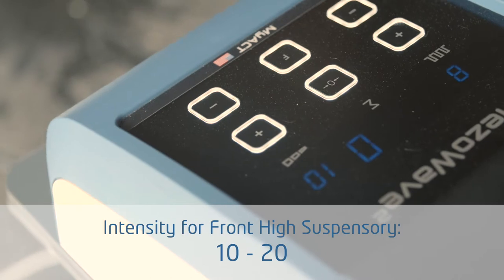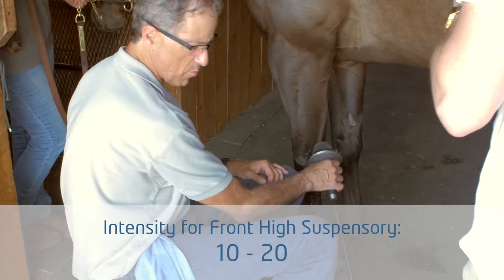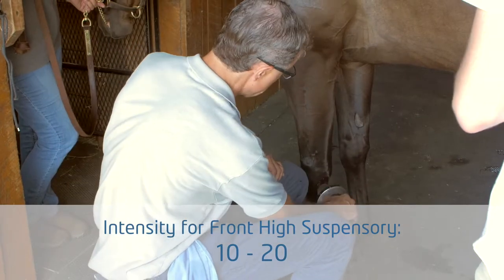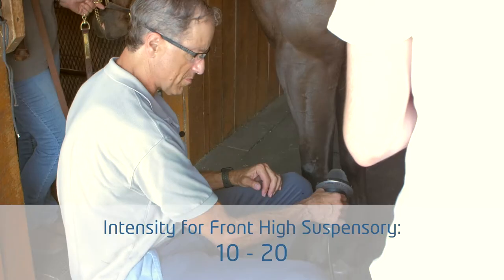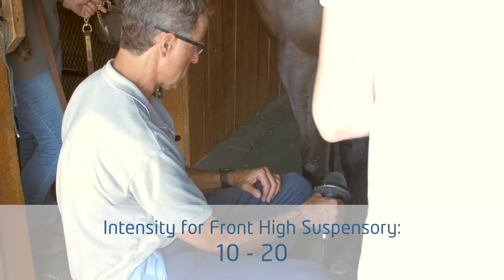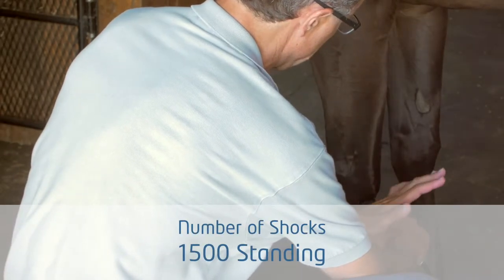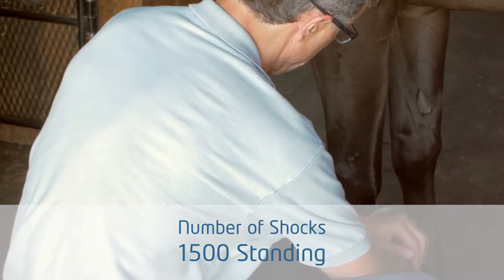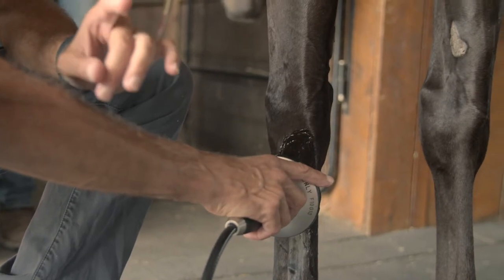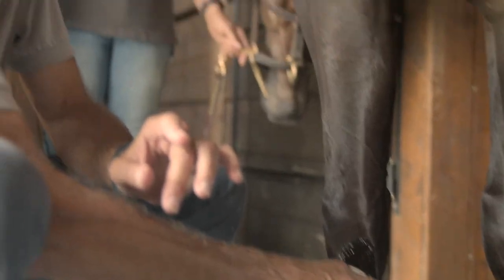I'm starting off at level 10 for safety purposes, at eight clicks per second. As expected, he doesn't have any problem with that. I'm going to go all the way up to 15 — he's fine — and then up to 20. I start here and put about 1,500 clicks in standing, slowly migrating down.